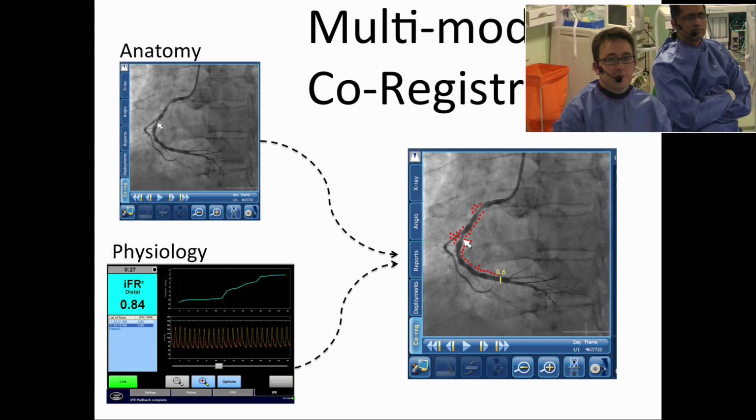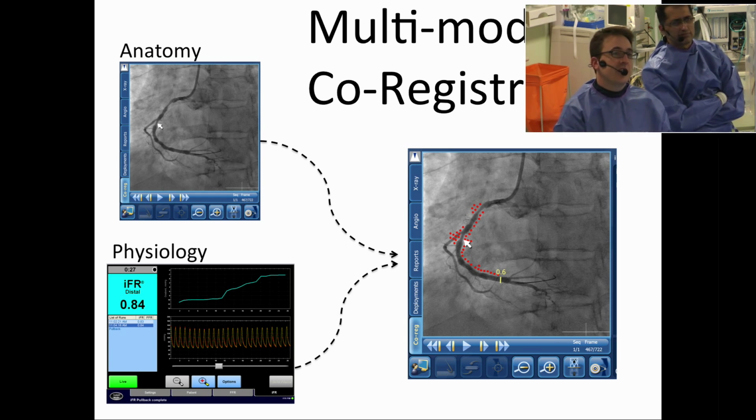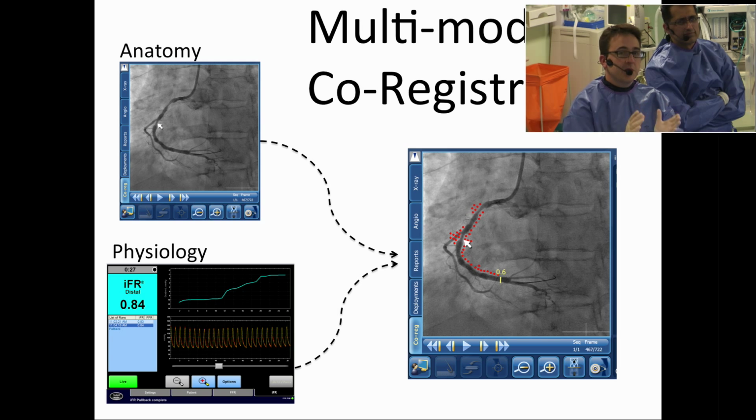And in the graphical representation here, you can see there's a very nice simple visual display of an artery. Now this perhaps could be an artery similar to what we saw today, maybe slightly different, and the real difference here is you can see there's areas of diffuse disease where you see just the odd single red dot, interspersed with areas where you see much more focal disease. So you see there's that area in the middle, and an area more proximal, which is more focal.